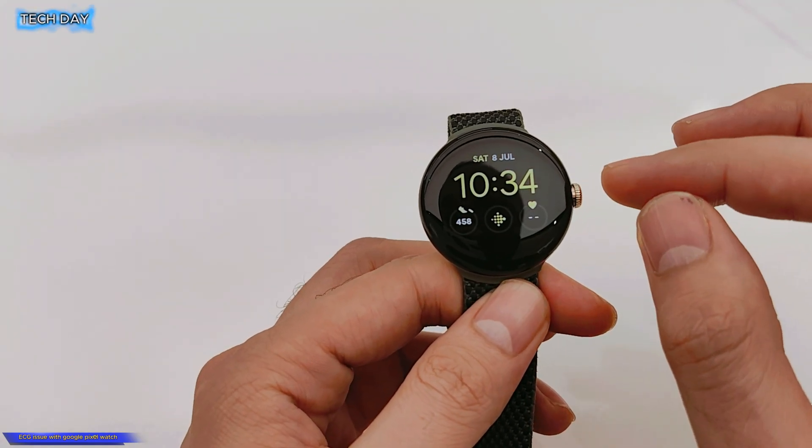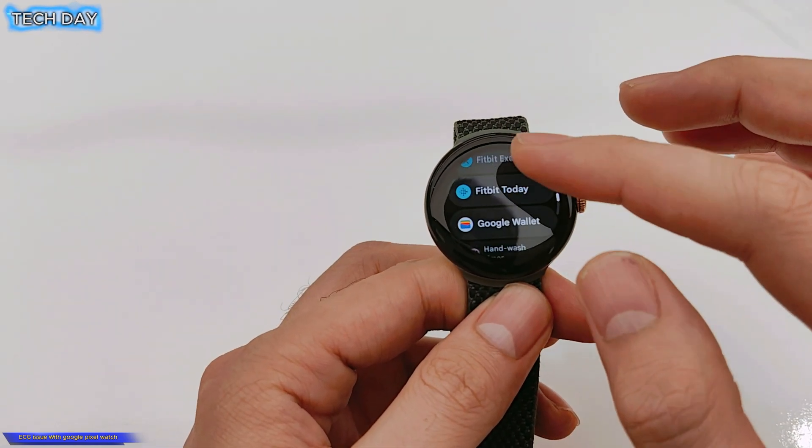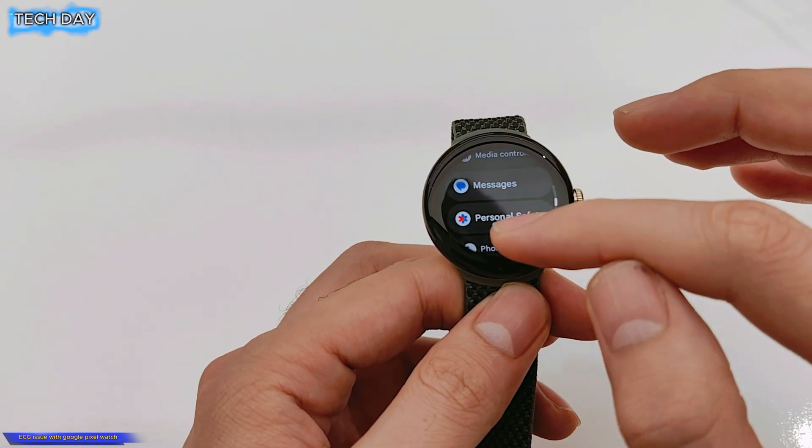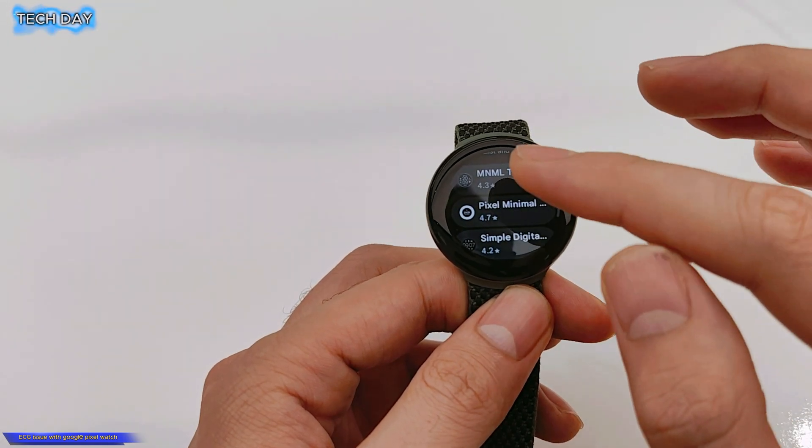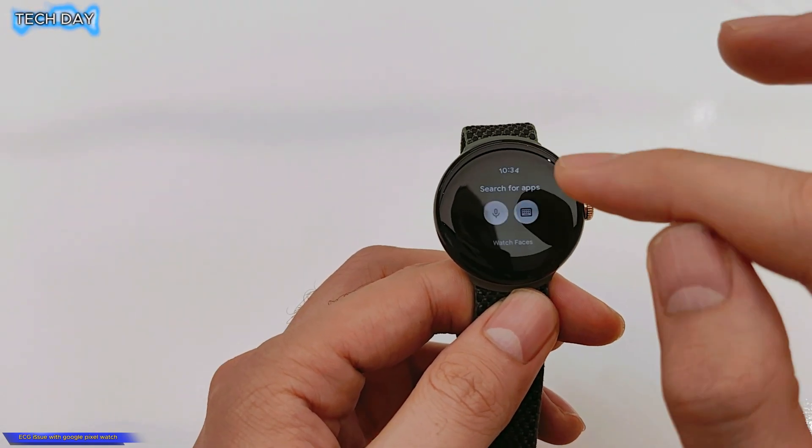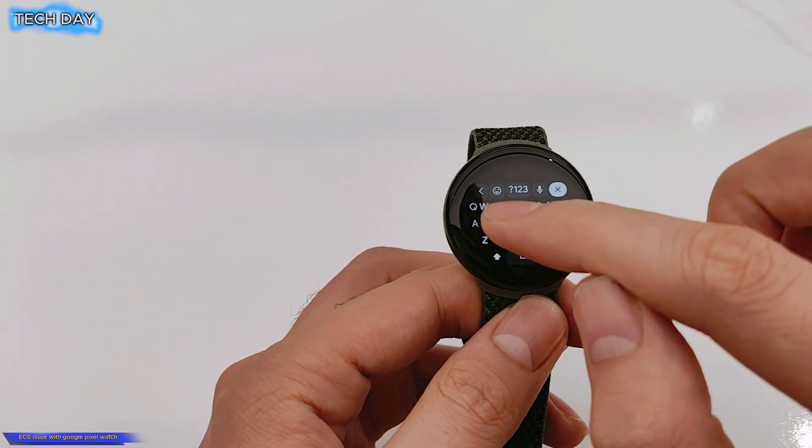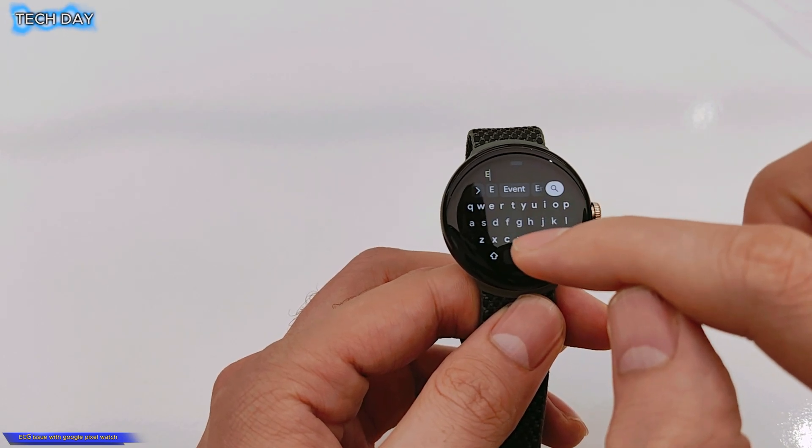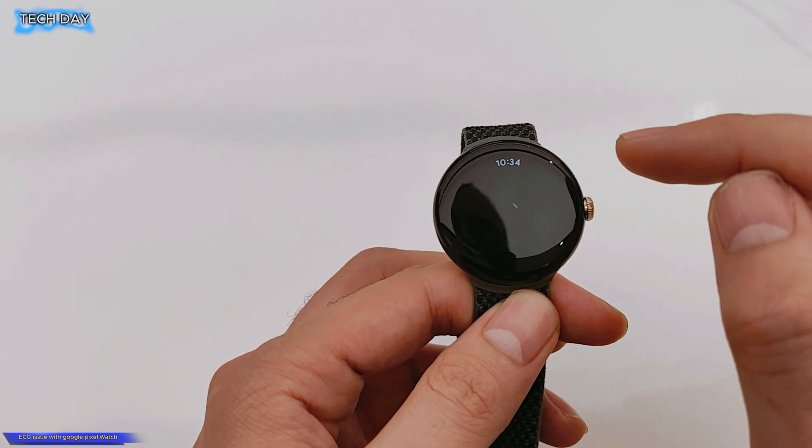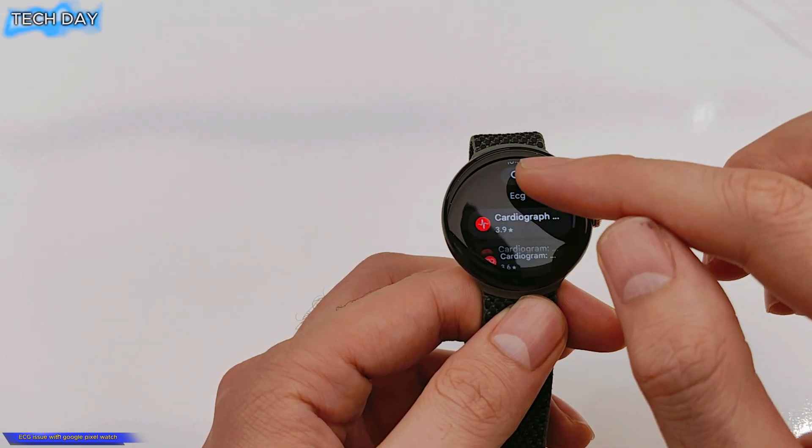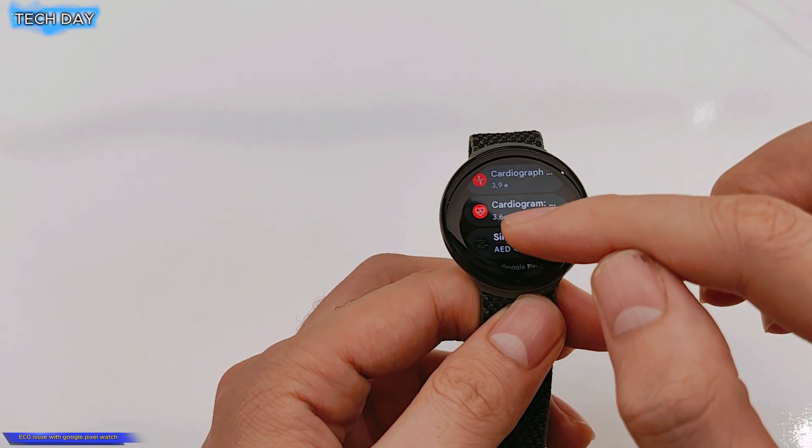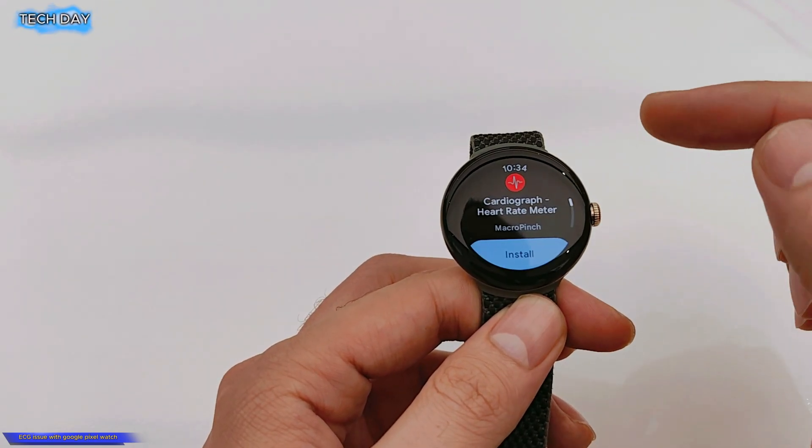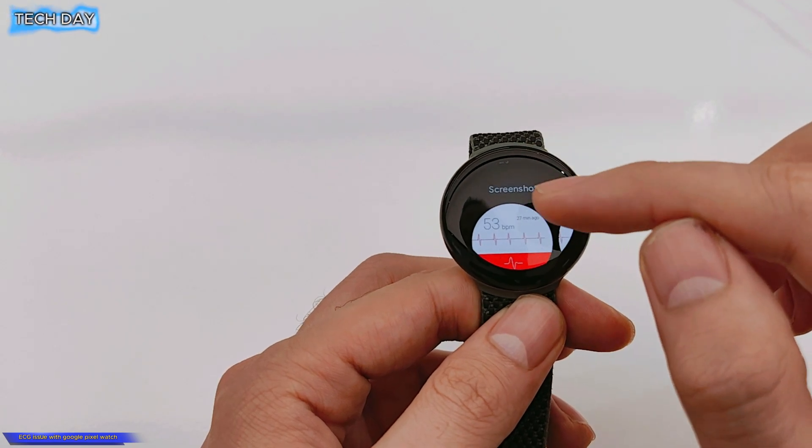Okay, I have faced this issue even if I search the ECG Fitbit I cannot find it. So like you can see it's not coming, this is a different application, this is not the same one.